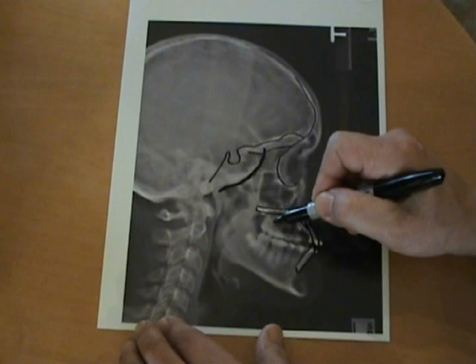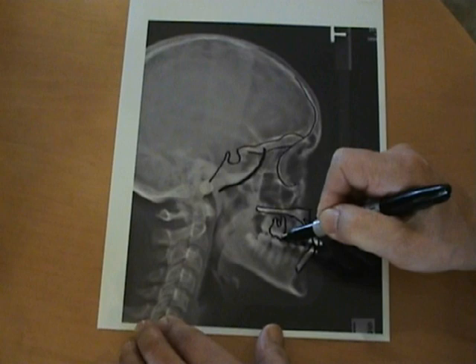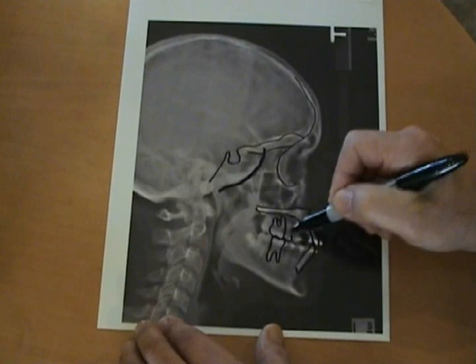Bicuspids. The six-year molar. The maxillary six-year molar. The lower six-year molar. The bicuspids.